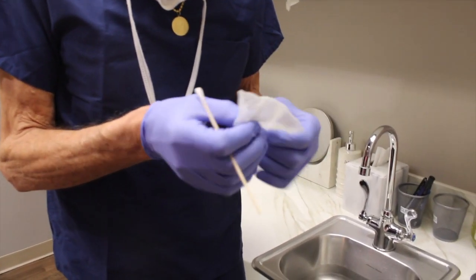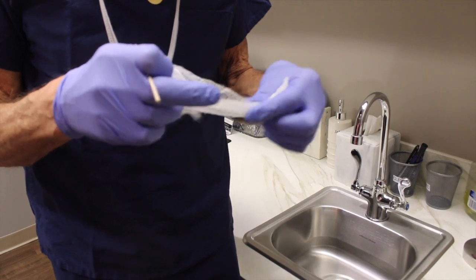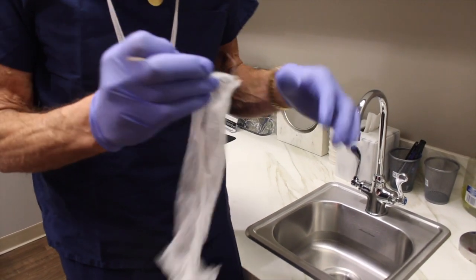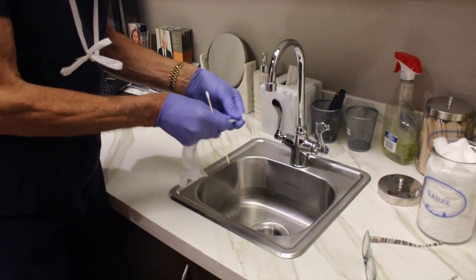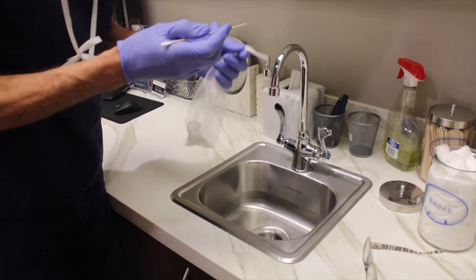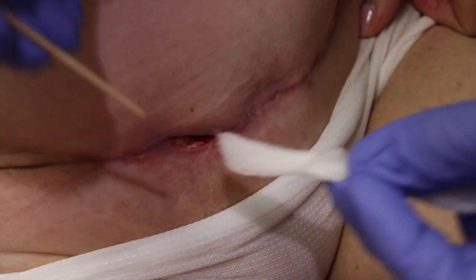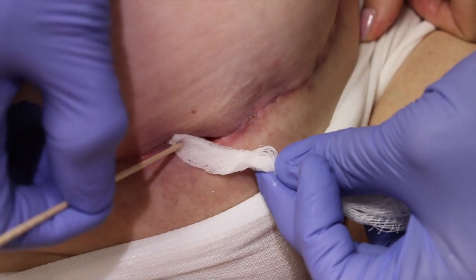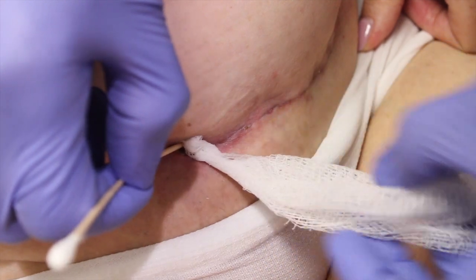You want to take a piece of gauze that does not have any paper in it — this is a cloth piece of gauze. You want to moisten one corner of it with tap water and wring it as dry as it goes. Then you take something like a little Q-tip and insert it into the wound. Take this little piece of gauze, put it by the opening, and just insert it. The moist part goes inside.